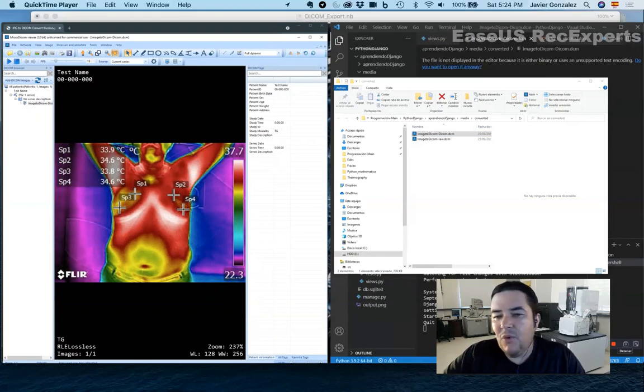In order for us to access that temperature information, we would need to make our own viewer. I know that it's not helpful for an interpreter to analyze this image, but I'm doing it just to prove that this file is indeed a DICOM file. It's not a proof that with a free DICOM viewer you can send it to an interpreter and change the settings, the emissivity, the lower temperature, the higher temperature, the palette or whatever. It's just the proof that this file is indeed a DICOM file.